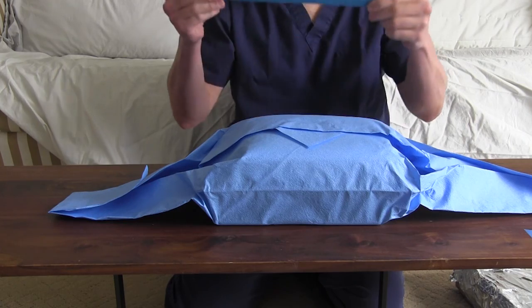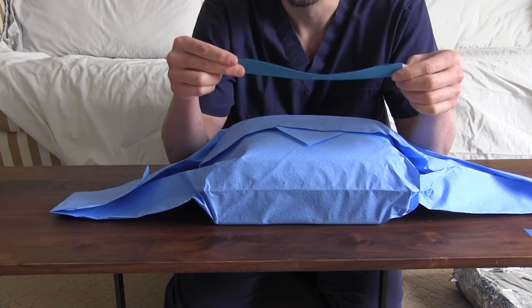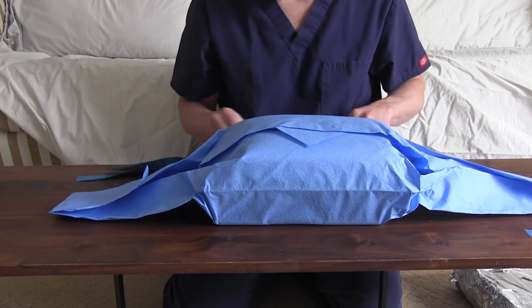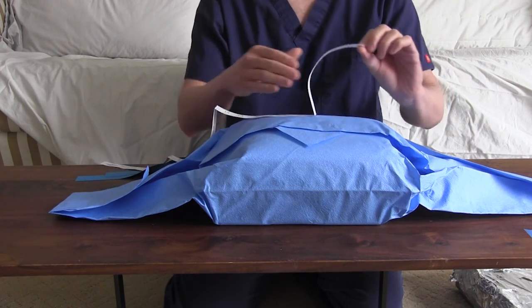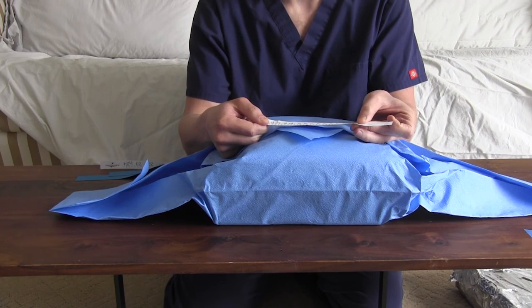So you could pop on, this is a non-sterile tourniquet. It was sterile when it came out, but the point is you could use it non-sterilely. You could pop this on the arm. You could use your ultrasound to actually find which vein you want to use. And then you could measure from that vessel to your actual site you want to have the tip end up at.